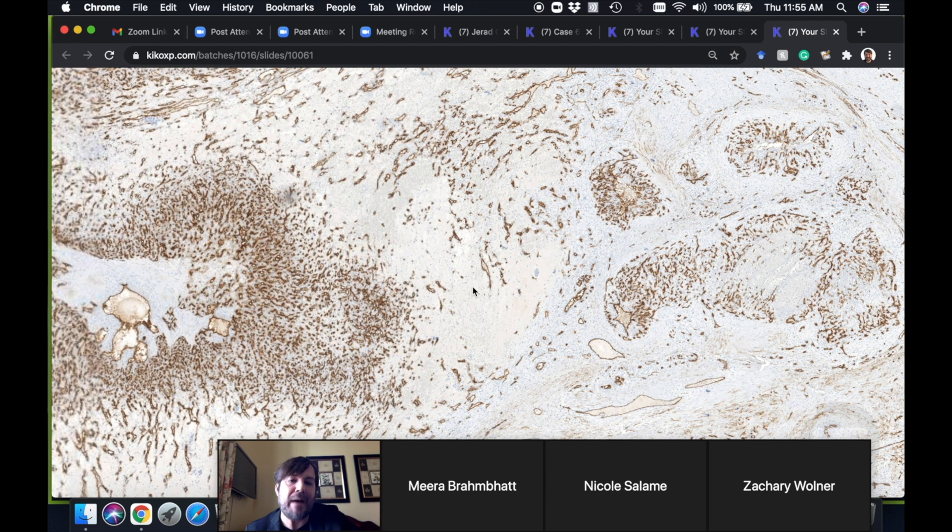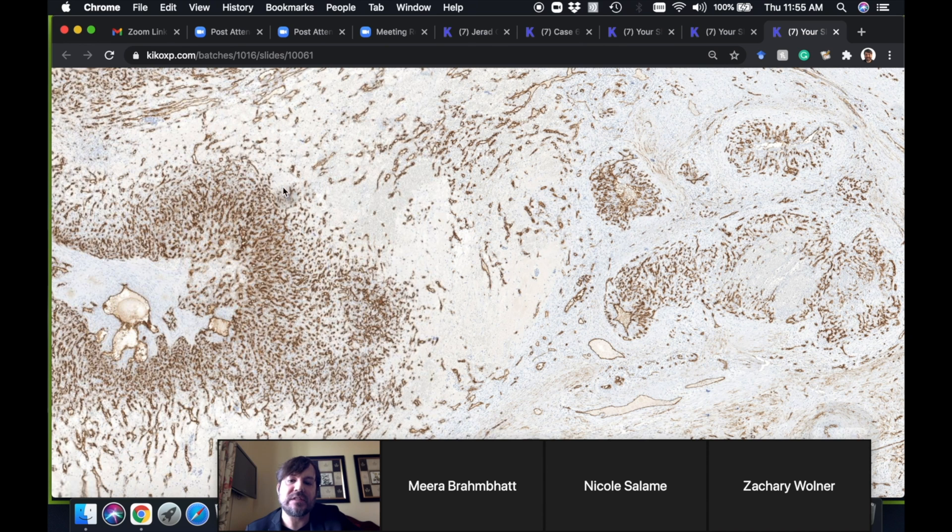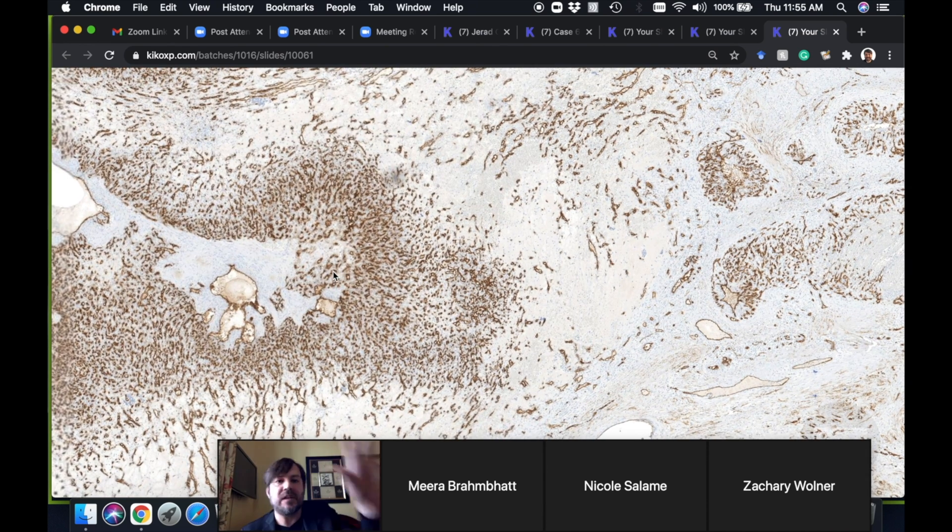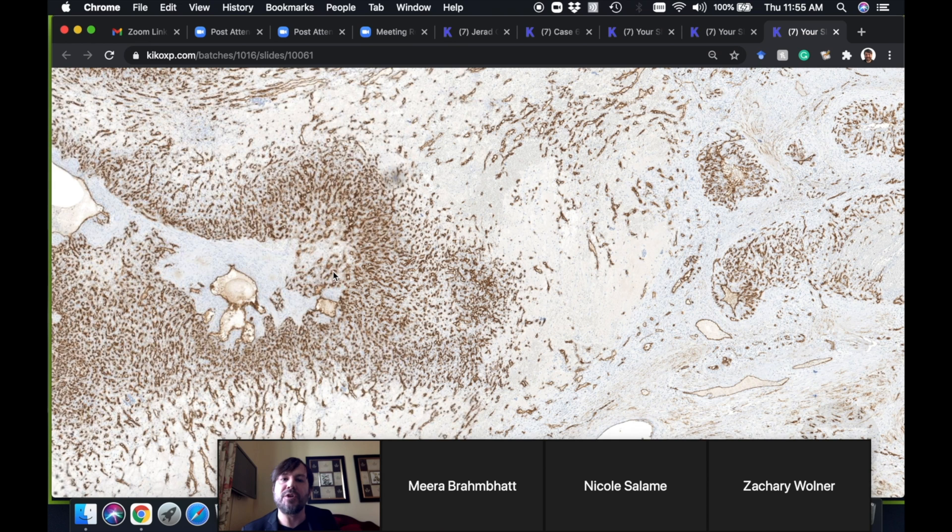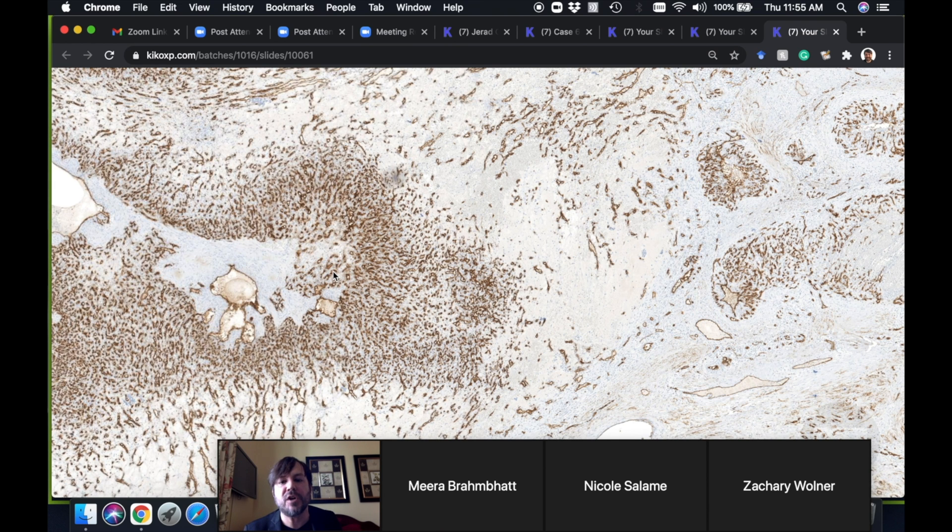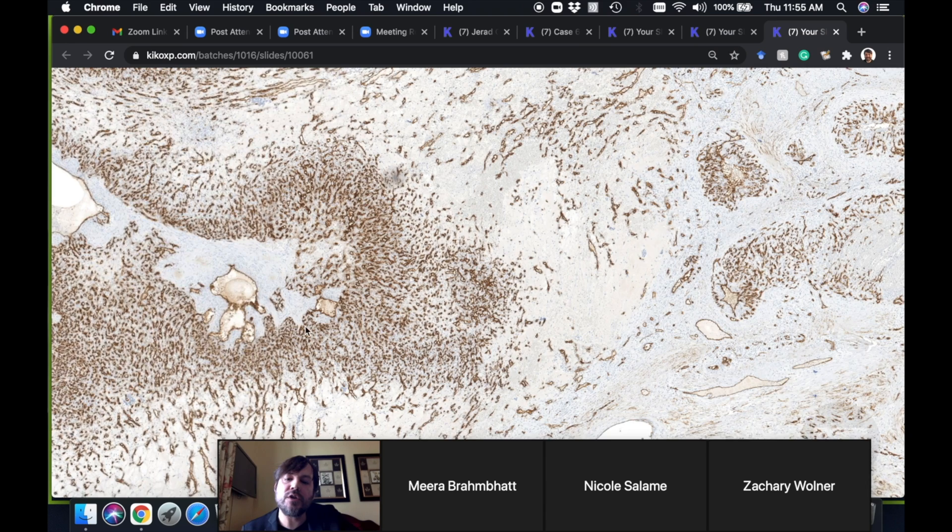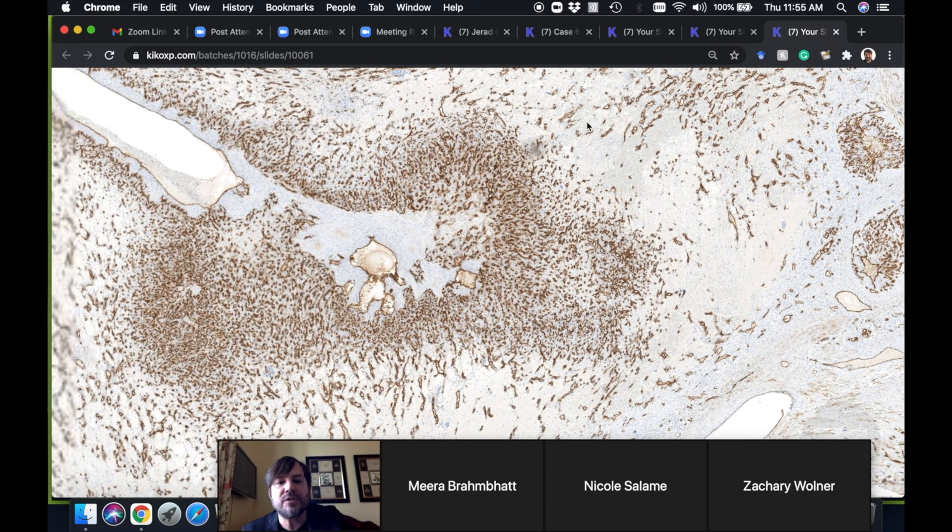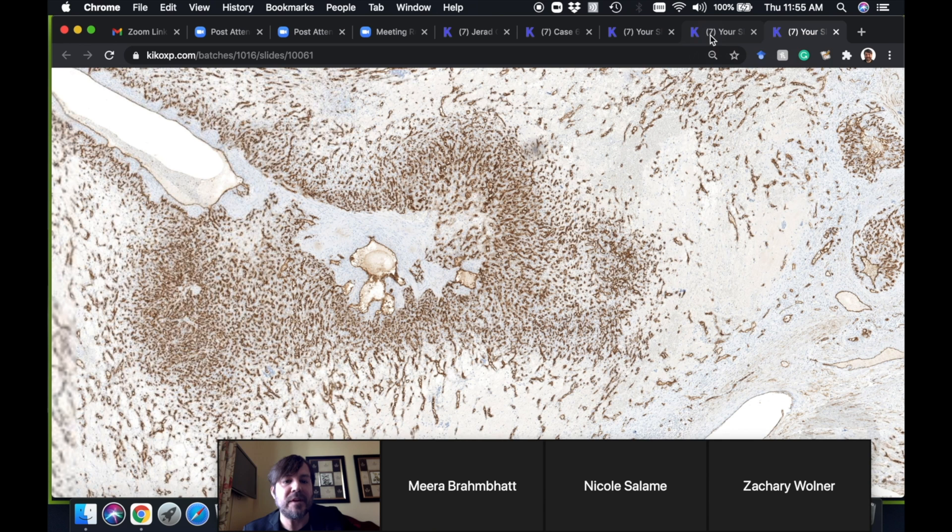So in this lesion here there's very little background, so the CD34 is quite clean. In a lesion that has a background that's not normal dermis, when you're looking at normal dermis in the background, CD34 can be pretty dirty and hard to interpret. So you can use different markers for different things. That was more for the people going into derm path and for the derm residents—I'm sorry, you probably won't need that for your real world.